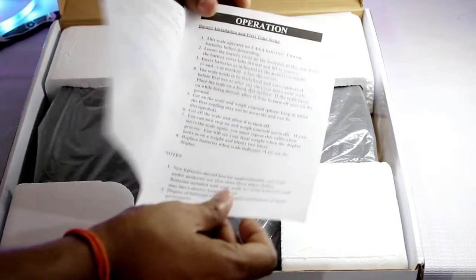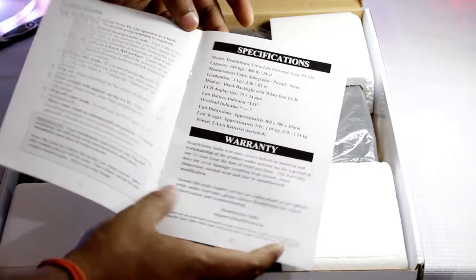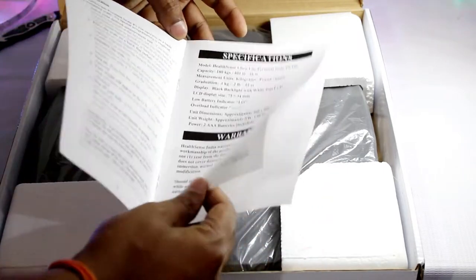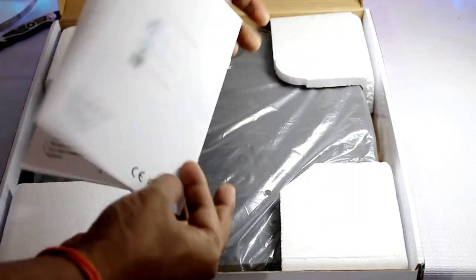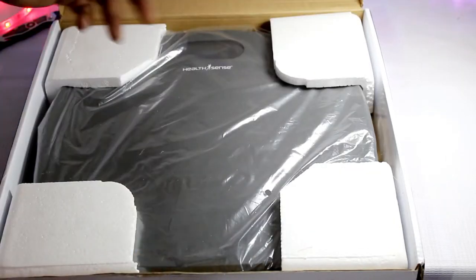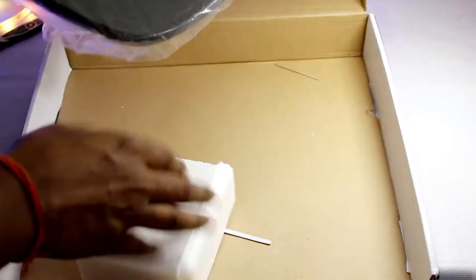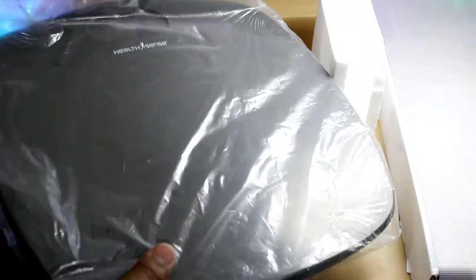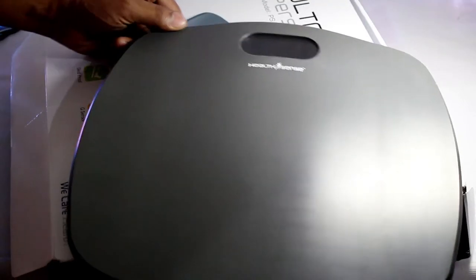Now here we have the user manual. It's precise and self-explanatory, so make sure you go through this at least once before operating the weighing scale. Finally, it's time to take a closer look at this HealthSense ultralight personal scale, so here we have it.